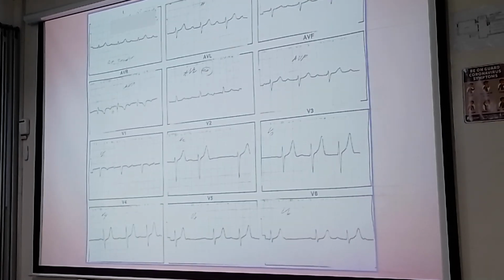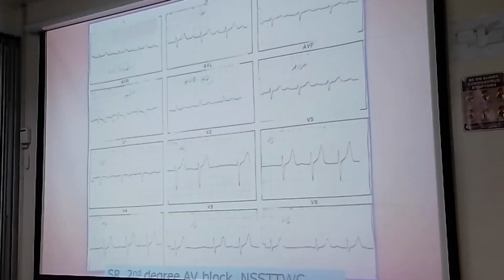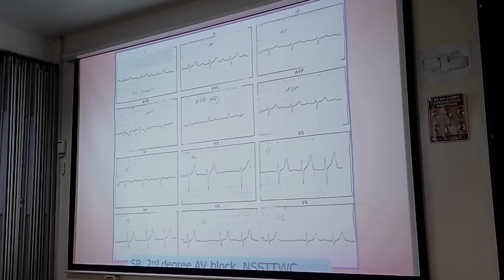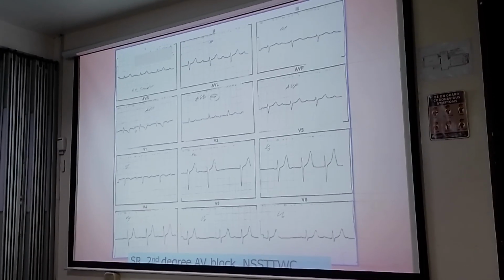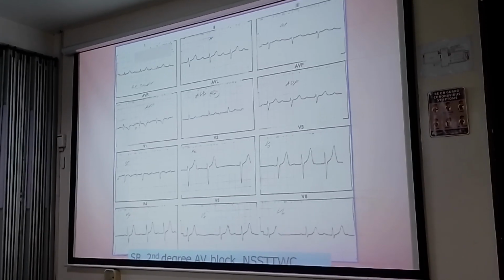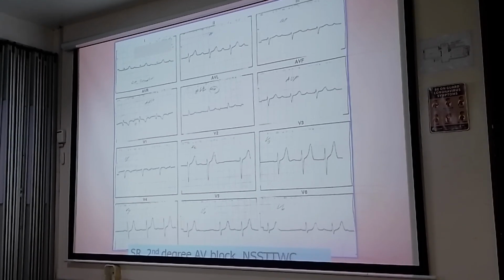Here, look at what you have here. Look at the T waves. Very pointed, but it is unfair to show this to the student and ask to identify second degree block. Second degree block is defined as you have two types actually: Wenckebach, type 1, second degree, and type 2. The Wenckebach type is you have the PR interval that is normal, and it lengthens and lengthens and lengthens until there's a warning, and then the QRS is dropped. The second degree AV block, Mobitz 1 or Wenckebach, Mobitz 1.